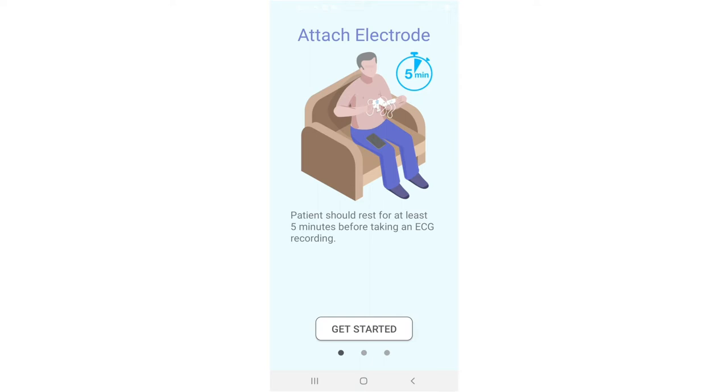Attach the electrodes. Patients should rest for at least five minutes before taking an ECG recording.